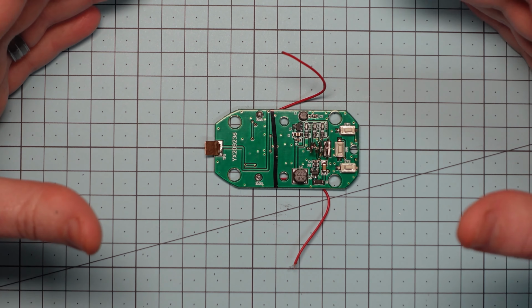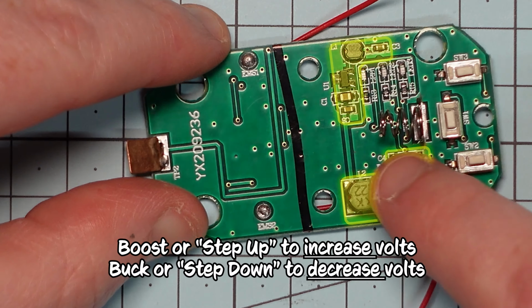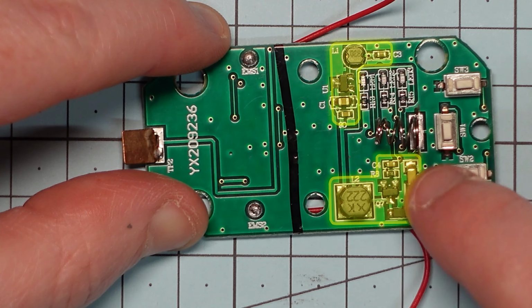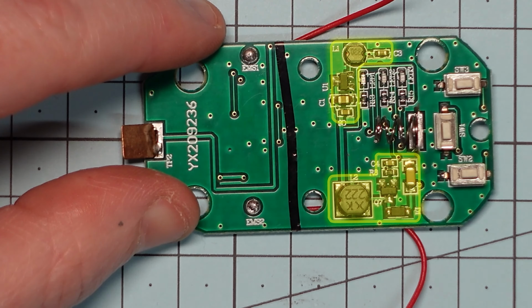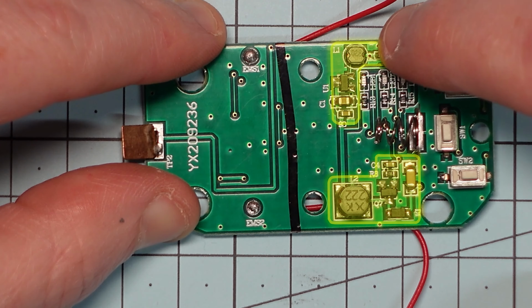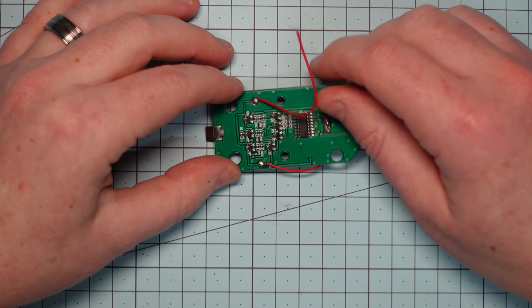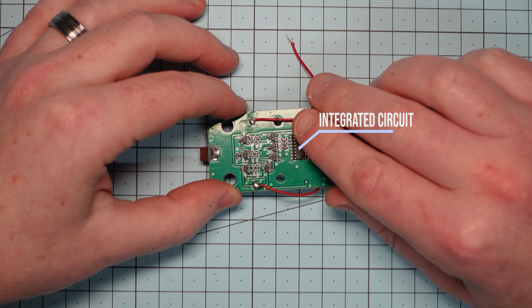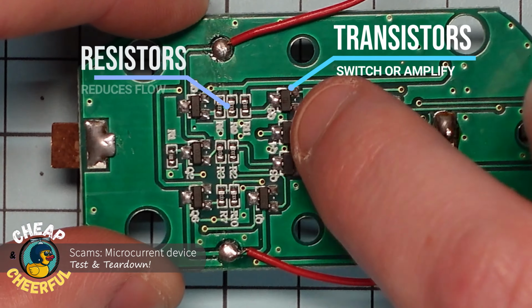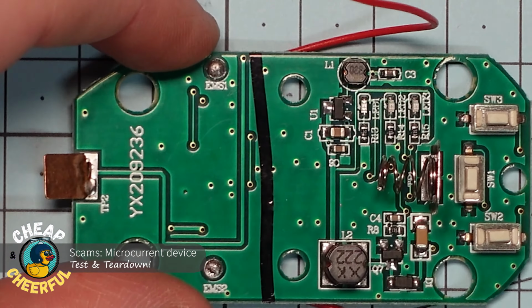First thing I noticed with this was 2 very obvious boost circuits. So you'll see this kind of design everywhere in all kinds of devices and all kinds of circuit boards. You'll see this layout just because it's a very simple and common way to boost voltage. Big one here, and I believe this is another one here, much smaller one. So they've got those 2, got the switches obviously, battery coming in here. Got an IC here, so integrated circuit to handle the logic. When you press buttons it does different things. Got a whole set of transistors here, so electronic switches. Those are the main components.